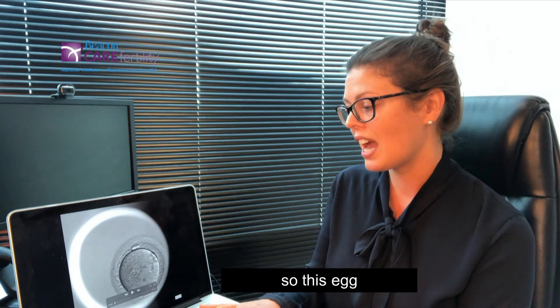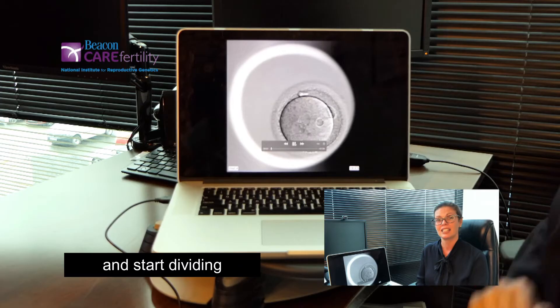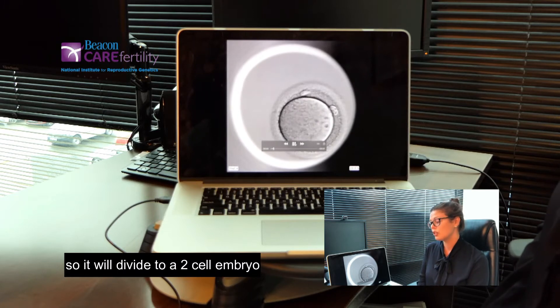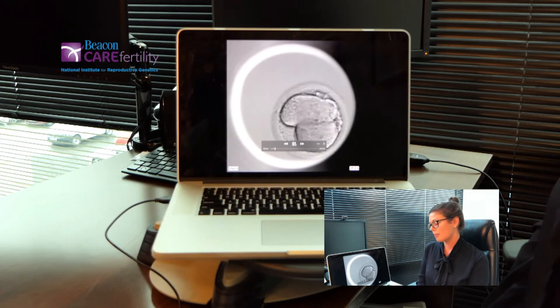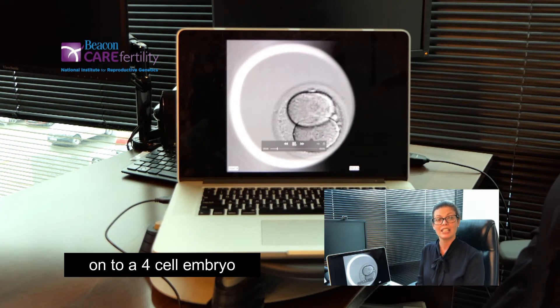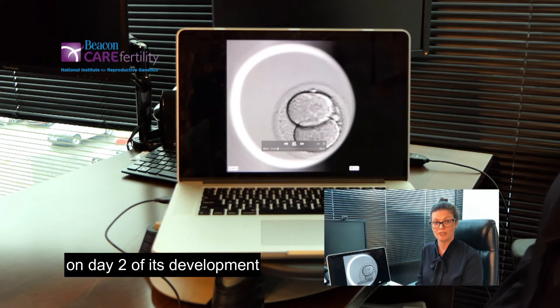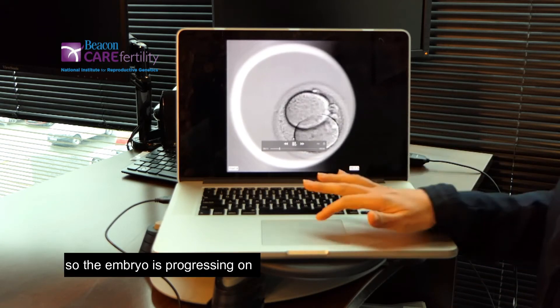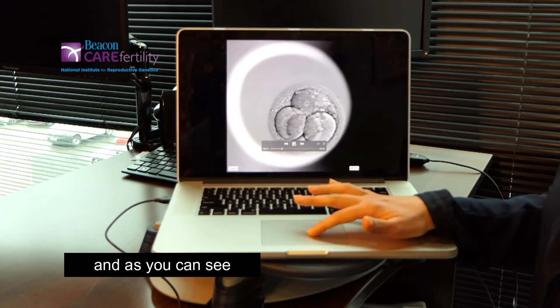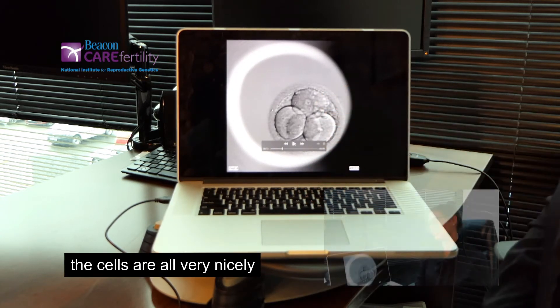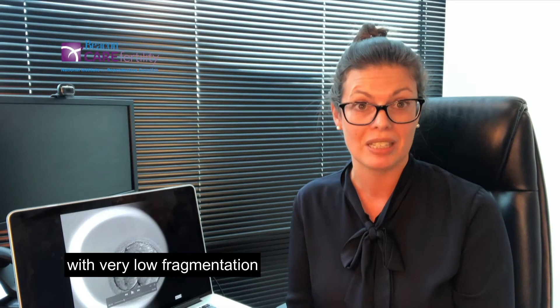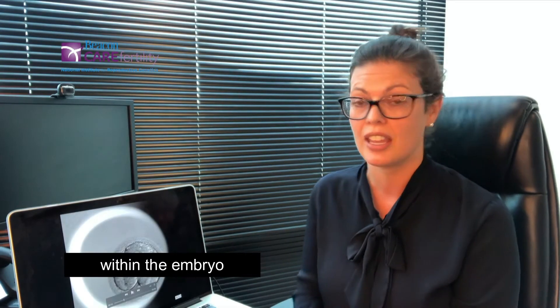This egg will continue on its development and start dividing. It will divide to a two cell embryo onto a four cell embryo on day two of its development. The embryo is progressing on and as you can see the cells are all very nicely equal in size with very low fragmentation within the embryo.